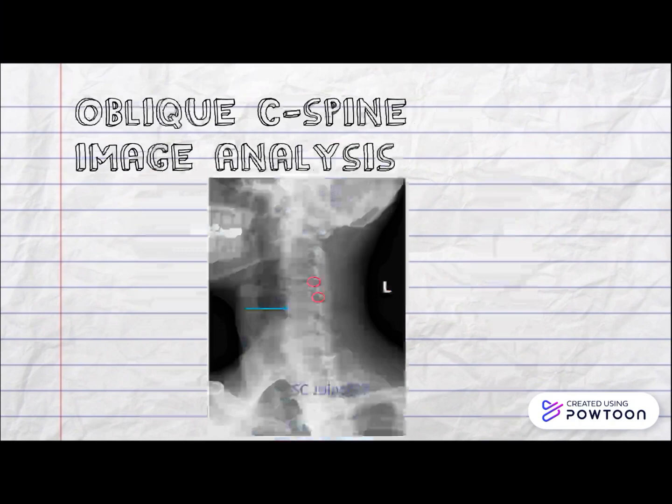The key indicator, again, is the opposite pedicle, which has the blue arrow pointed to it. And the opposite pedicle is almost in the middle, or almost close to the IVFs. Over-rotation of more than 45 degrees would cause one pedicle to be foreshortened, while the other pedicle aligns to the midline of the vertebral bodies, which is clearly demonstrated in this image.